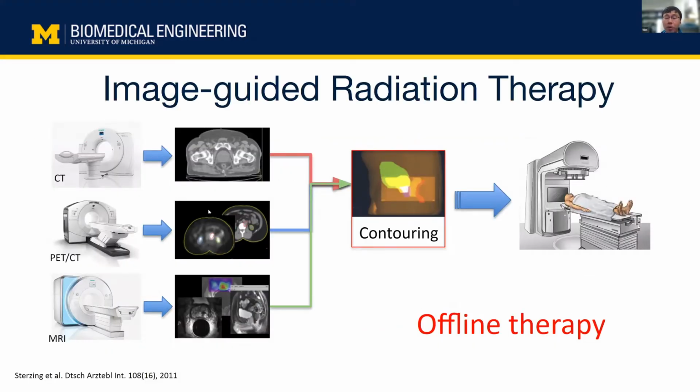So as you know, radiation therapy is one of the commonly used modalities for tumor control, and it has shown very great treatment outcomes. Actually, most radiation therapy is image-based. Here we want to mention that we are targeting external beam radiation therapy.